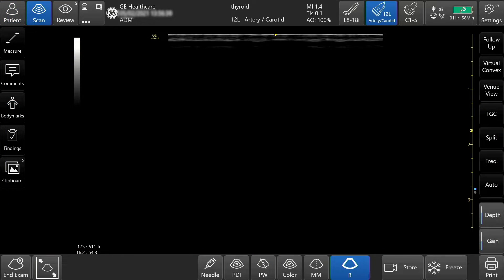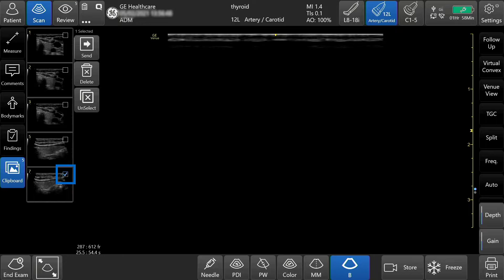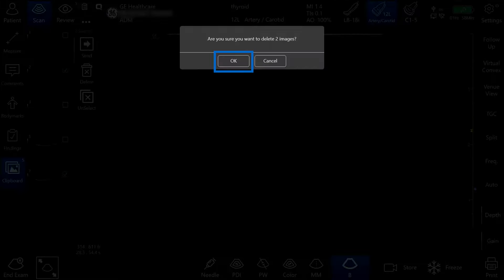To delete images during an active exam while scanning, tap the clipboard. Select the image or images you would like to delete. Tap Delete and OK.